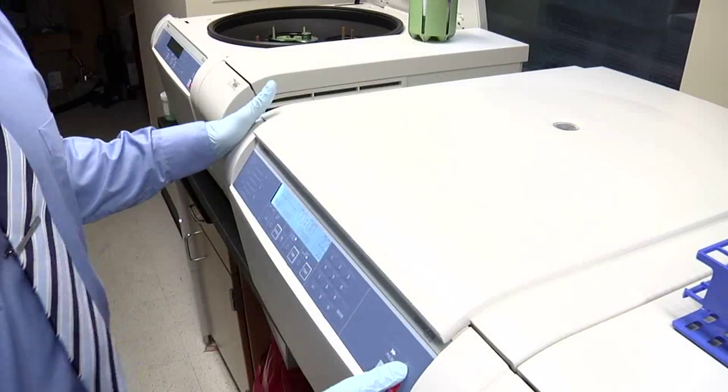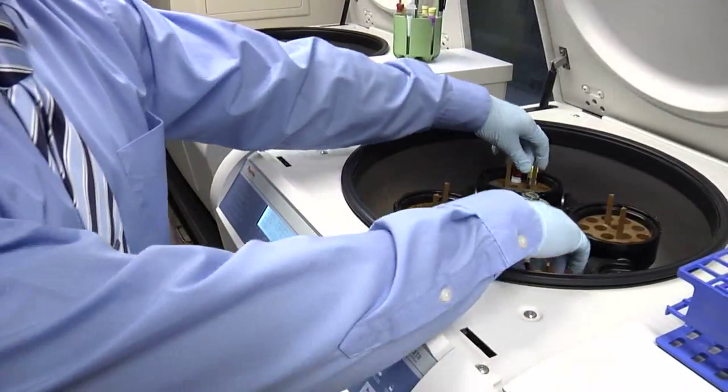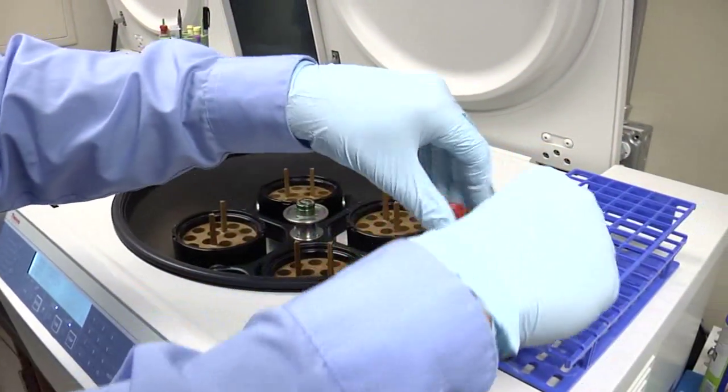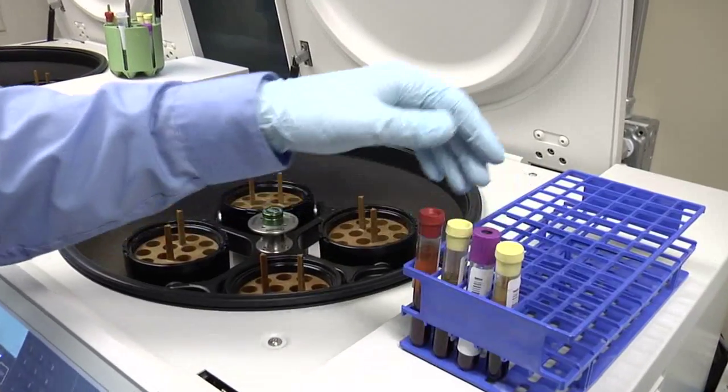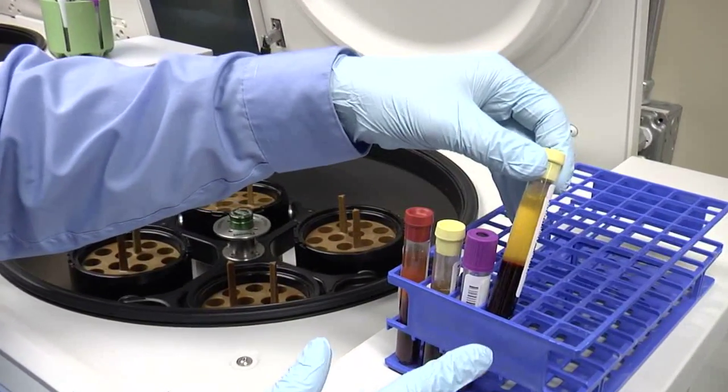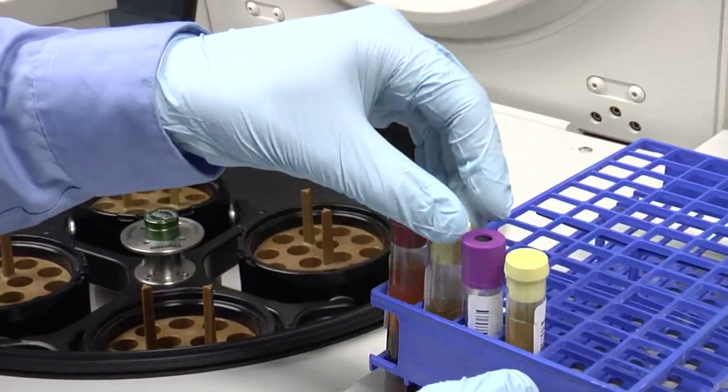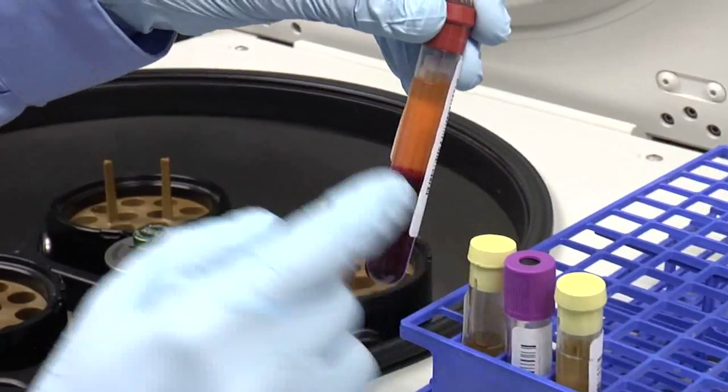After the spin is complete, open up the centrifuge and take out the samples. You can see the sample has been separated into plasma, buffy coat, and packed red blood cells for these three tubes, and for the fourth, it's only serum.